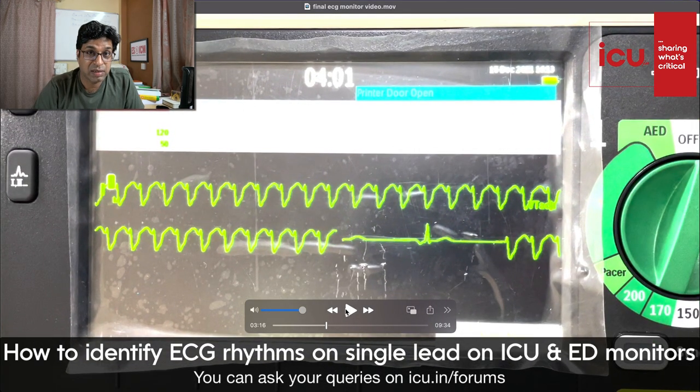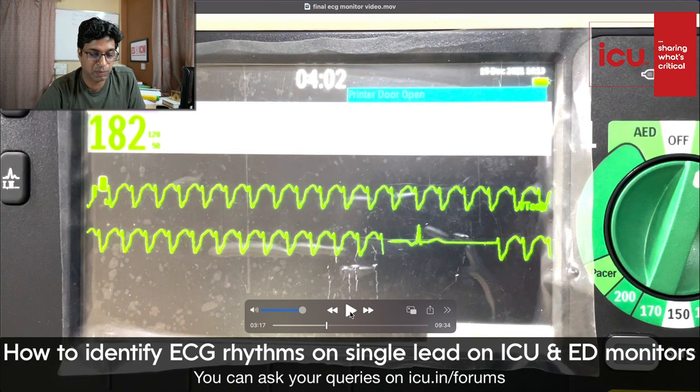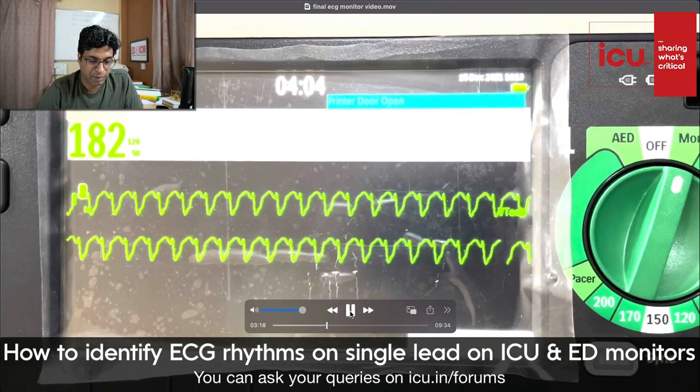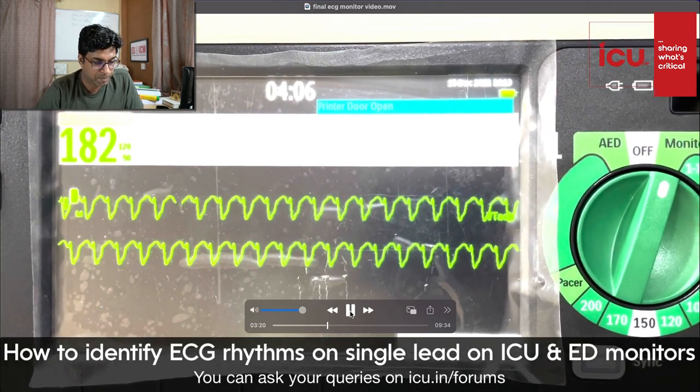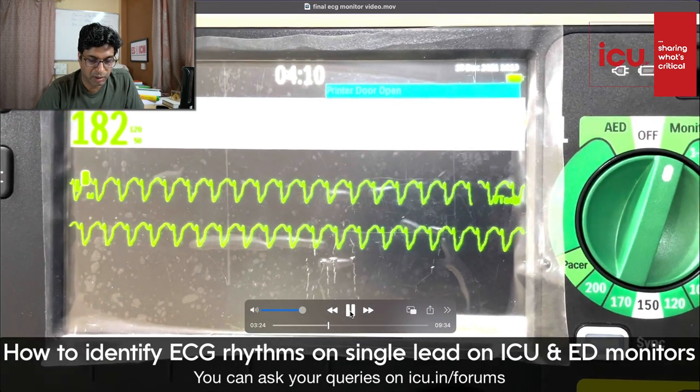Check the pulse. If it is a VT with pulse and hemodynamically stable, you can try pharmacologic interventions. If it is not, shock the patient. If it's pulseless VT, do shock the patient. Okay, VT.